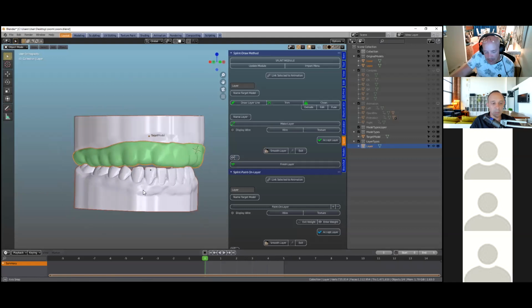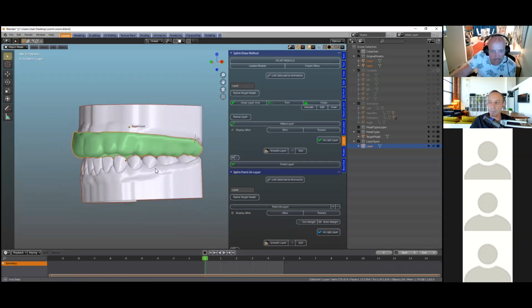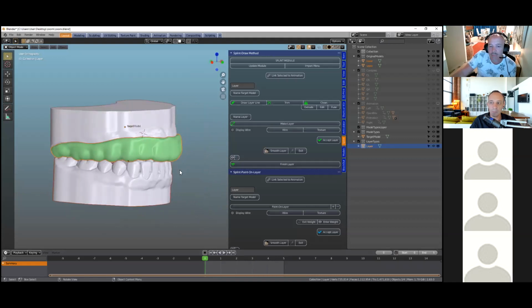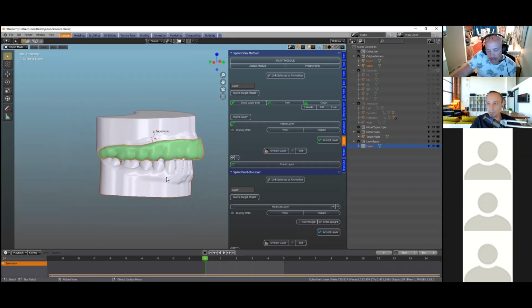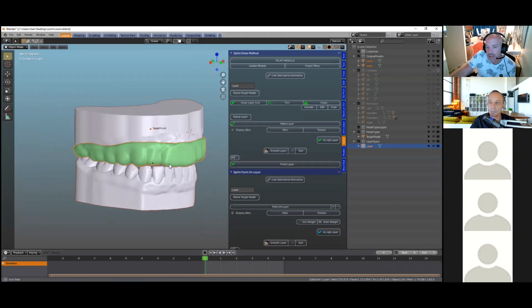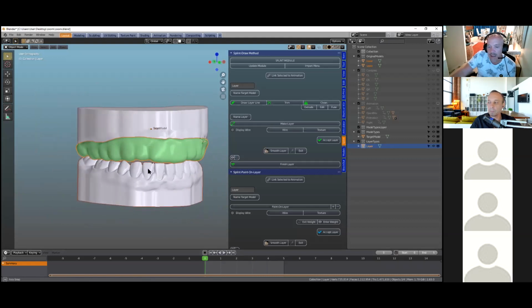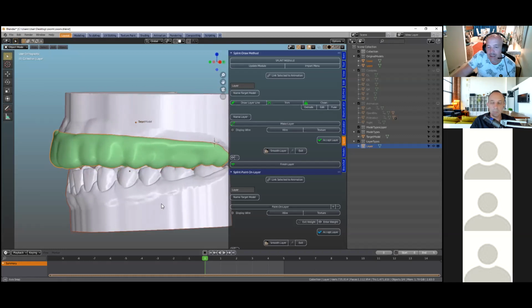And yeah, I've seen in my dental career, I've made a lot of splints, just the conventional suck down hard soft material, and some of my clients have used this without any buildup of the occlusal layer, which essentially means that all the patient is doing is biting on the back.